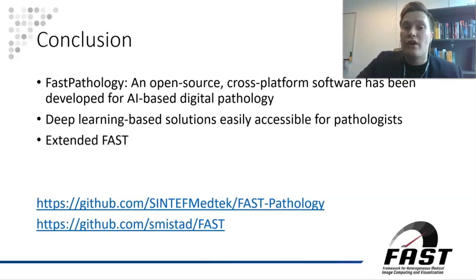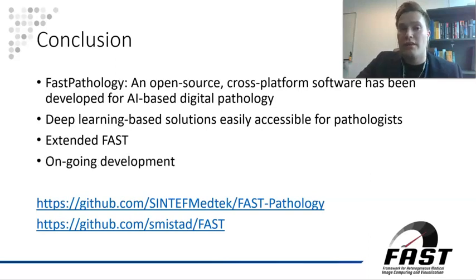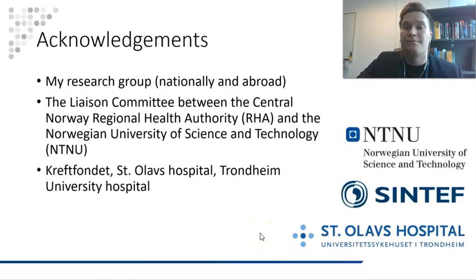We have also extended FAST to better support software development for digital pathology purposes. The project is continuously in development. We encourage the community to contribute to both of these open source projects on GitHub.